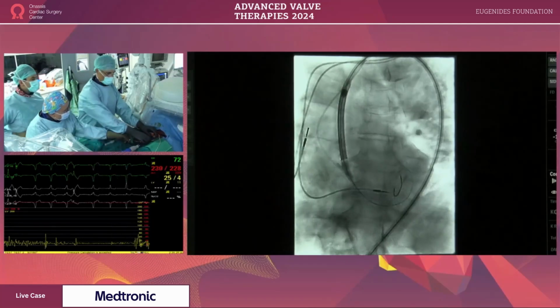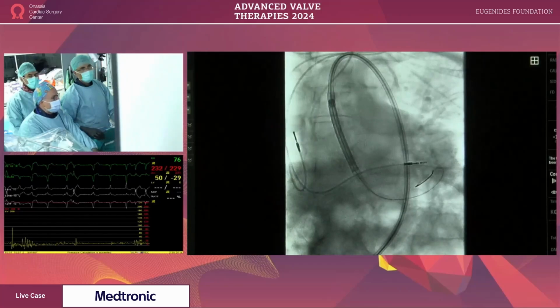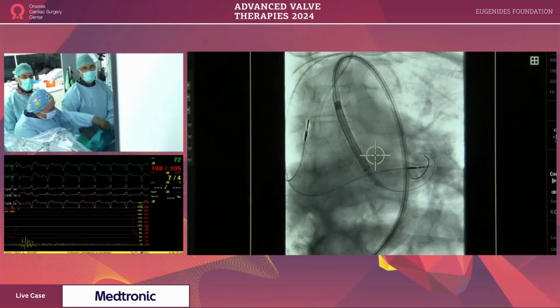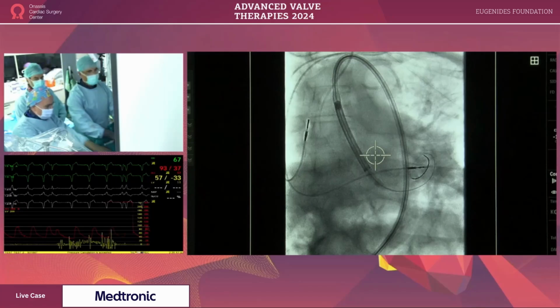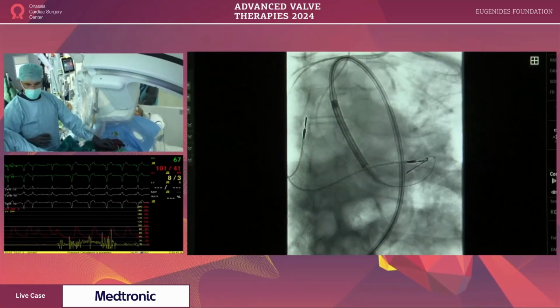Okay. We have the pressure. So the wire is not in the best position.